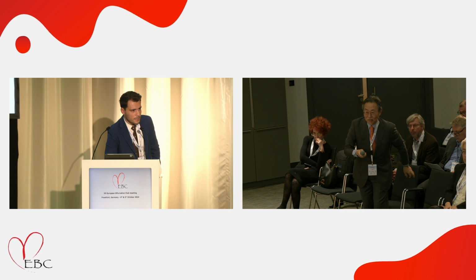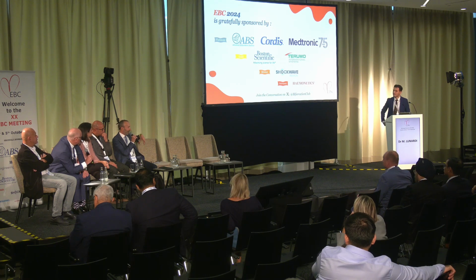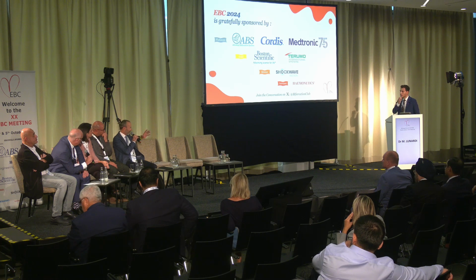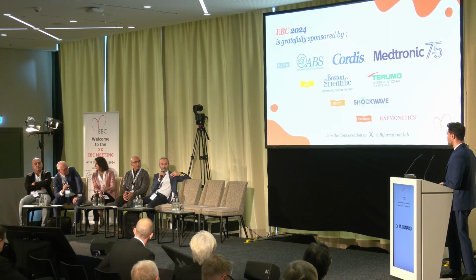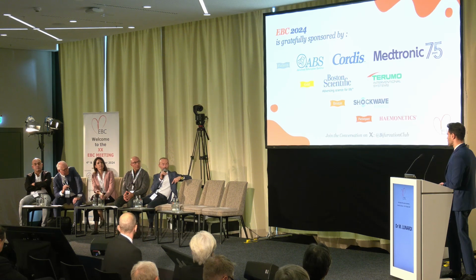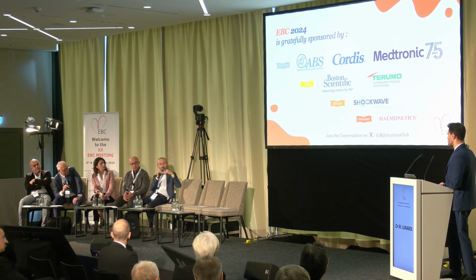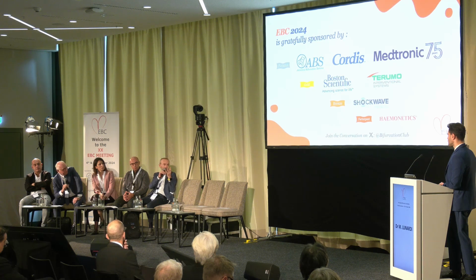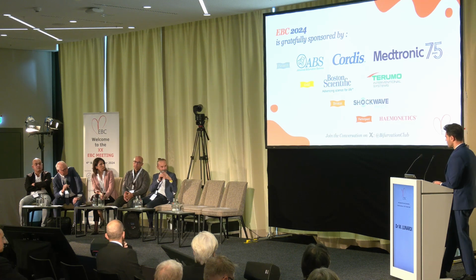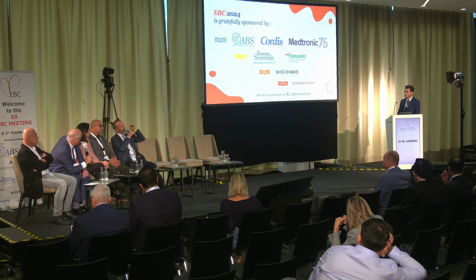Thank you very much for your final comment. One alternative to POT-side-POT is POT-side-main-POT, which is safer. The other is the kissing, because you don't know if you are angio-guided when you do the proximal cross. If you do a proximal cross, you have the neocarina in the middle. So in any case, you have this carina, which is toward the main vessel or the side branch if you go with the POT too distal. So it's probably better, at the end of this discussion, to do POT, side, or kissing, and then POT, but performed proximal to the carina. If you have a neocarina floating, it's in the middle.